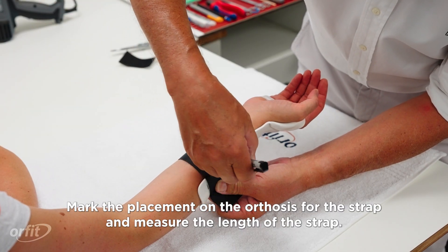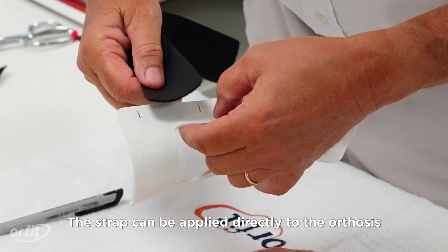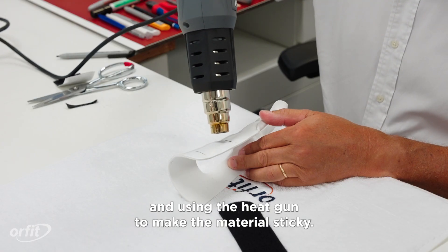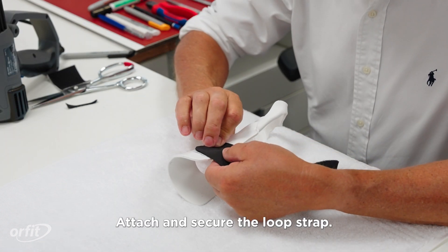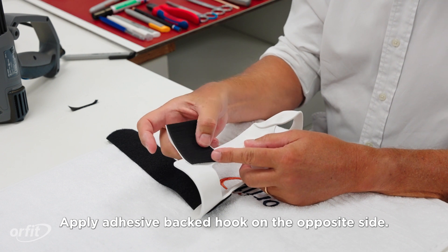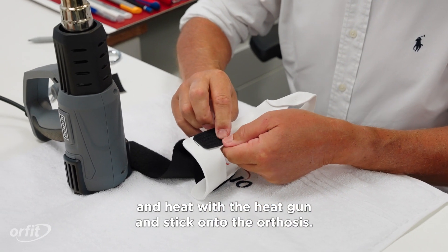Mark the placement on the orthosis for the strap and measure the length of the strap. Attach one forearm strap near the proximal edge. The strap can be applied directly to the orthosis by scraping off the non-stick coating and using the heat gun to make the material sticky. Attach and secure the loop strap, then apply adhesive-backed hook on the opposite side, round the corners, heat with the heat gun, and stick onto the orthosis.